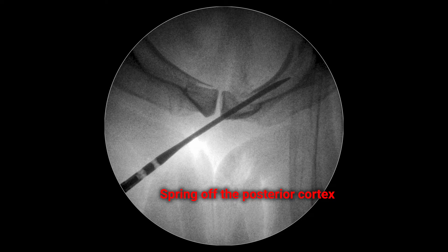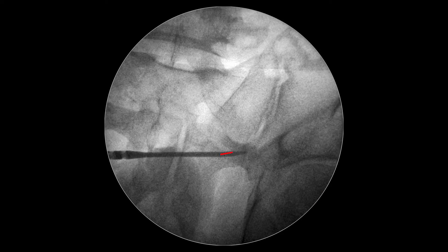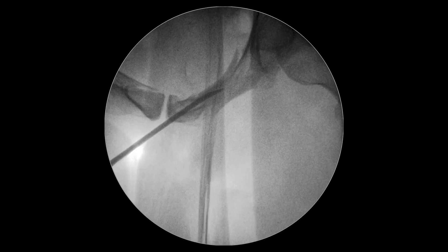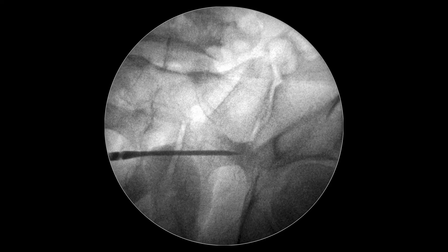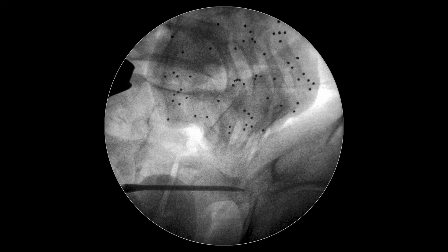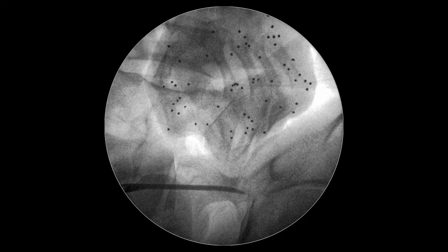The nail is springing off the posterior wall of the pubic bone — it can be seen that the nail tends to go out of the bone channel. We take the pin back, slightly rotating it. We change the direction of the nail's tip and reduce bones by pressing on the pubic bone with a finger.